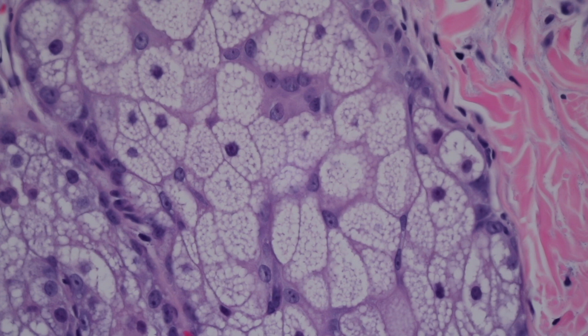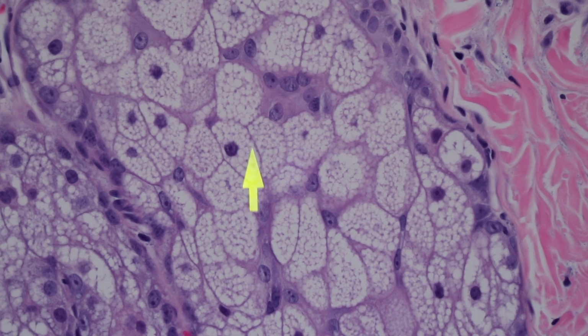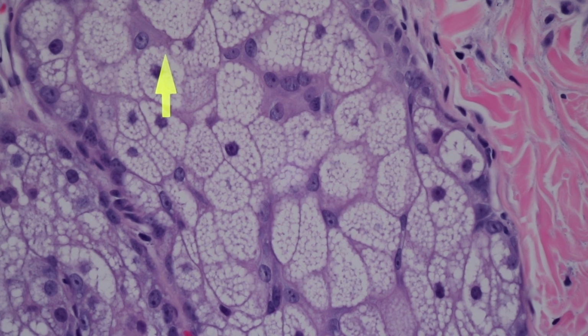So anytime you see a perfectly round little white circle inside the body, it's usually a good sign that you might be dealing with something that was fat that's been dissolved during processing, because fat only can make little perfectly round droplets. So these cells are called sebaceous cells, or sebocytes, and their cytoplasm is filled with little tiny vacuoles of fat. And when these cells all break down, we'll look at it in another section, they squeeze out of the gland into the hair follicle, and they make a type of secretion called sebum, or sebaceous secretion. So anyway, these are sebocytes, and this is a sebaceous gland.